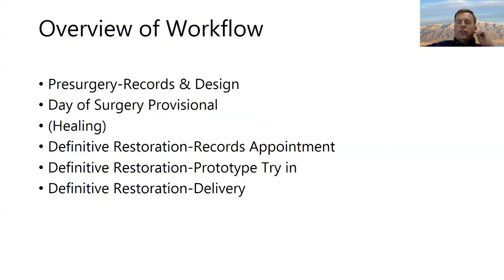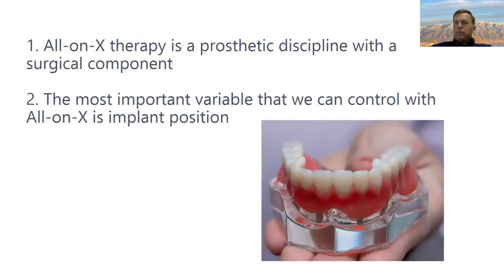My goal is to use this as our organizational principle. We're going to follow this workflow. So these are our 6 appointments at most. If we deliver a prosthetic on the day of surgery, then obviously it gets us down to 5. And as this slide keeps popping up, you'll see sections highlighted, and that's what we'll be addressing at a specific stage. So here we go.